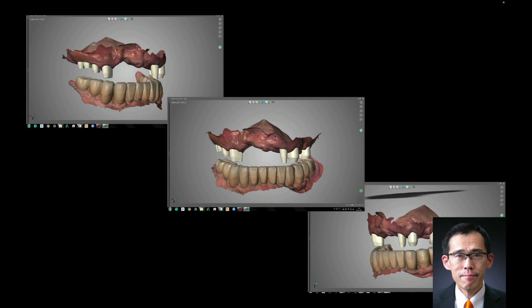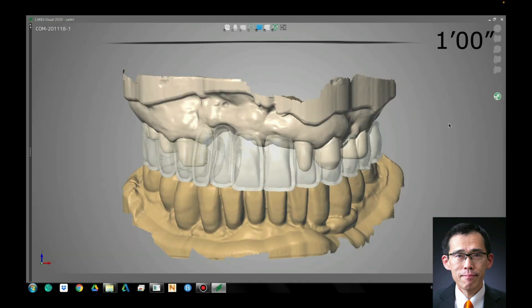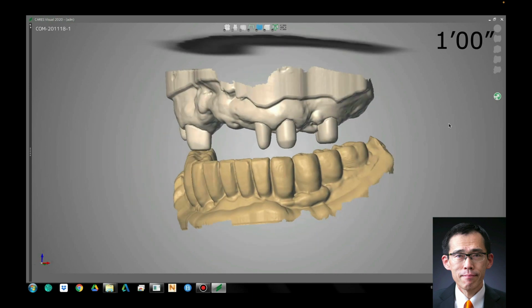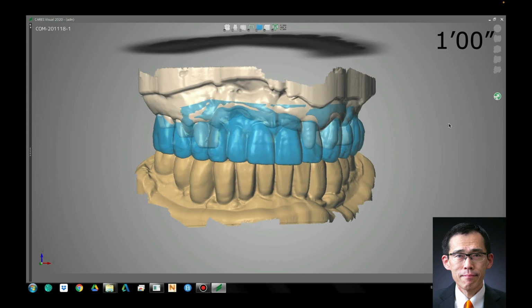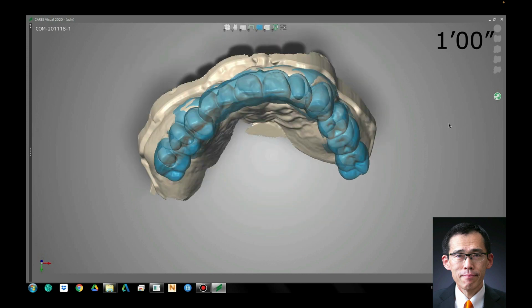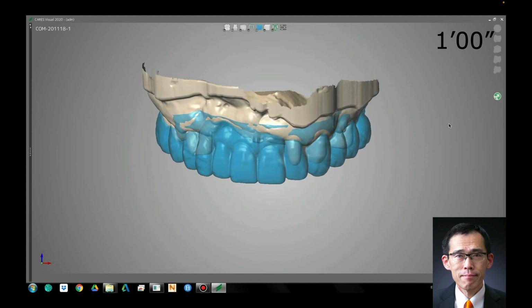After digital impression, Trios CAD design of the inner zirconia was performed. After designing the inner crown, the outer PEEK bridge was designed with CAD-CAM software.